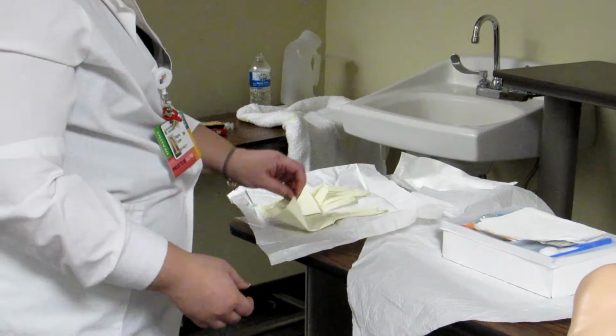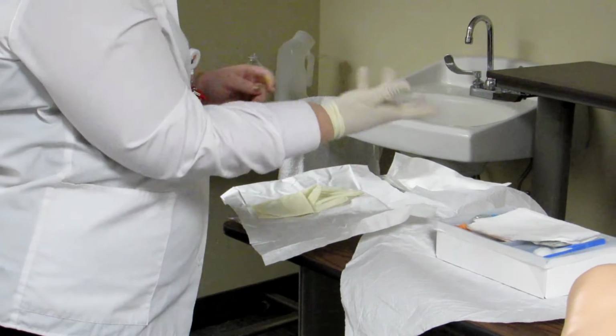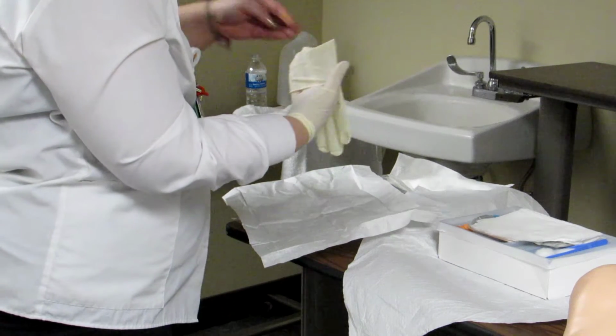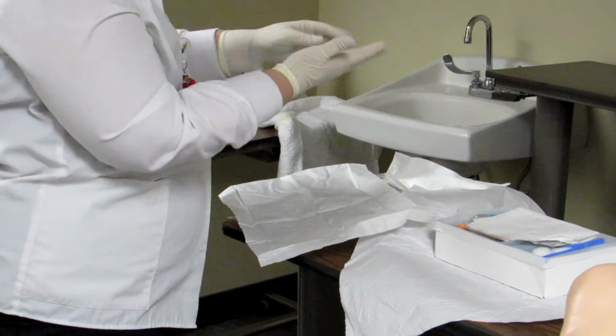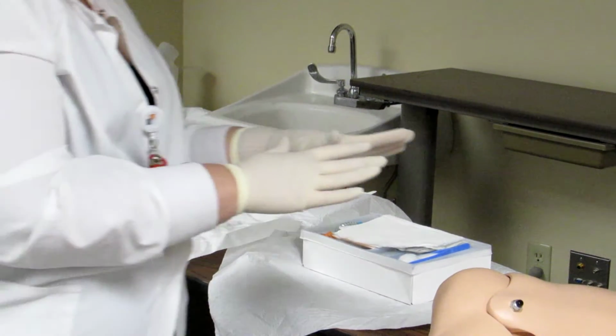I'm going to put my right glove on first. Grab it by the cuff. Pull it up. I'm going to reach under the cuff of the second glove. Hold your hitchhiker thumb out so you don't contaminate your glove. I'm going to go right up. I can then adjust if I need to. So from this point forward, everything is going to be sterile.